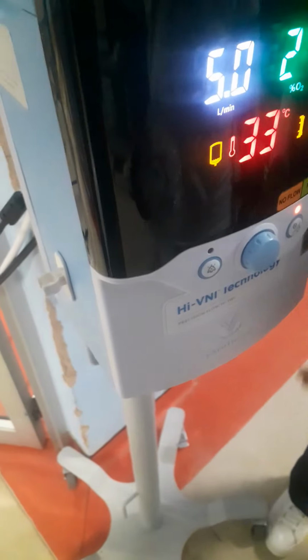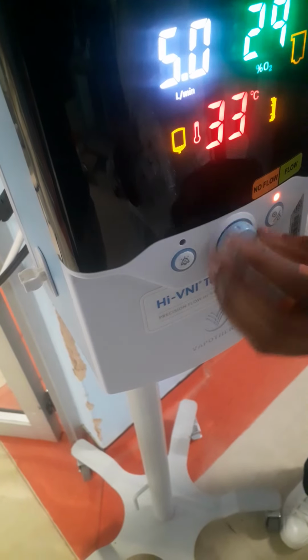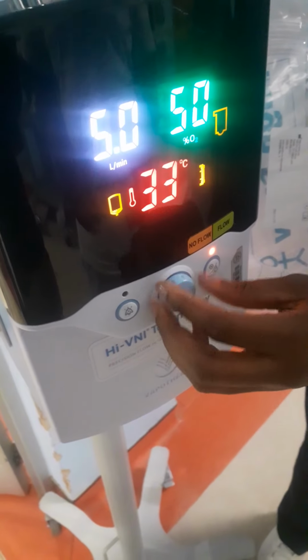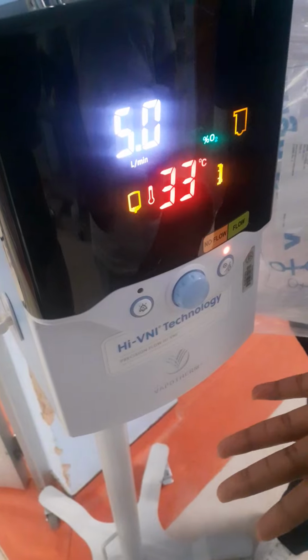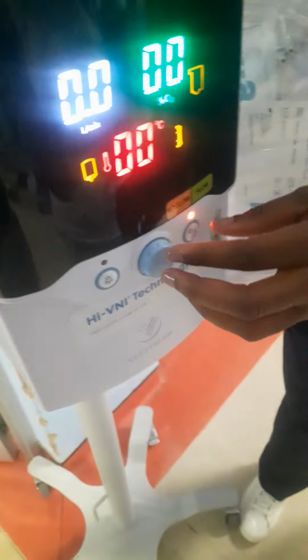Basically, how you set this one: if you touch it, the one that is flickering is what you are going to set. We usually start at 100% because we're trying to recruit the patient. But remember, oxygen is toxic.